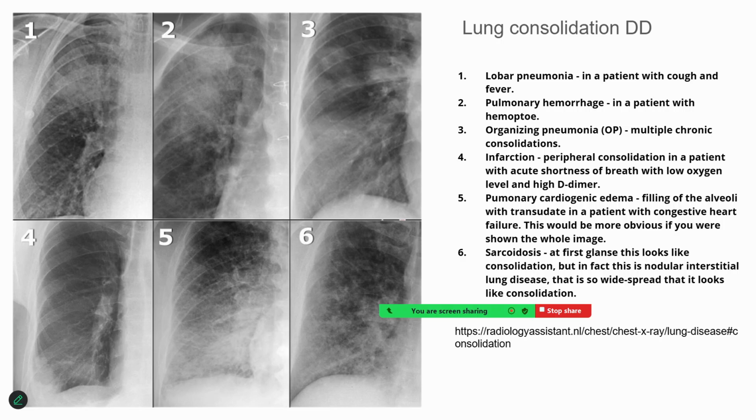Congestive cardiac failure, what we call pulmonary hypertension, also may occur in such patients. The edema would occur, but in these cases, again, it will always be in the gravitational dependent area, and by that, in all such conditions, because of the gravitational force, the congestion would be more in the gravitational dependent area.